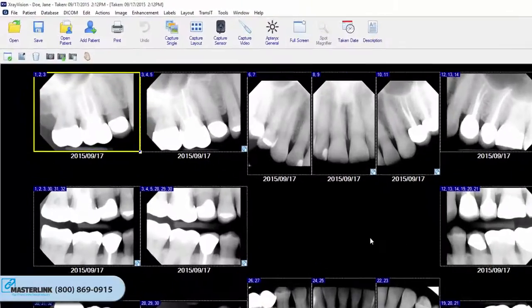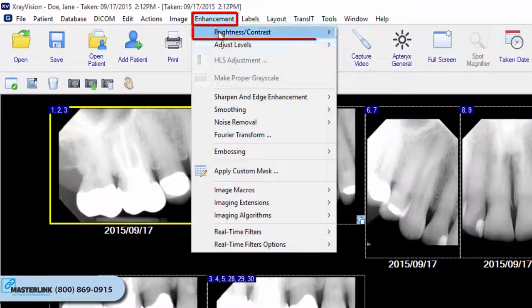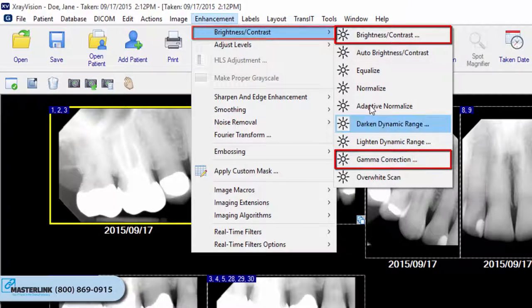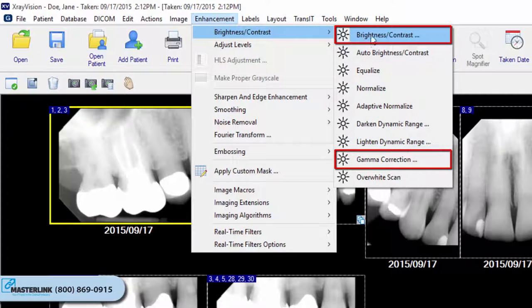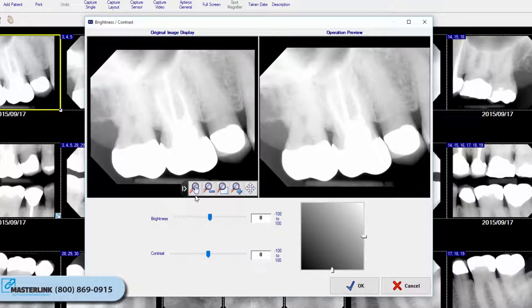To apply Brightness Contrast or Gamma Correction, select Enhancement, Brightness Contrast, and choose either Brightness Contrast or Gamma Corrections. The Enhancement window will be displayed. Use one of the following Image Adjustment buttons to size, resize, or reposition the images displayed in the original and resulting image preview windows as desired.